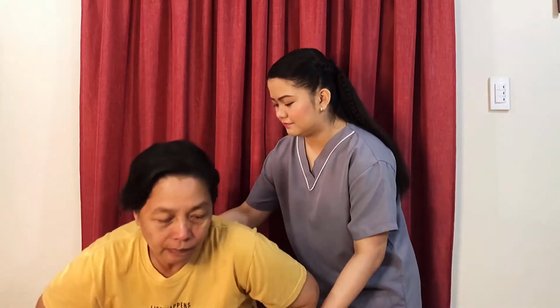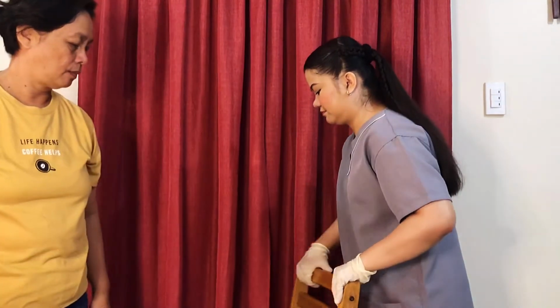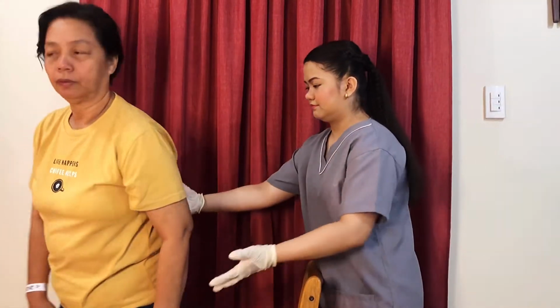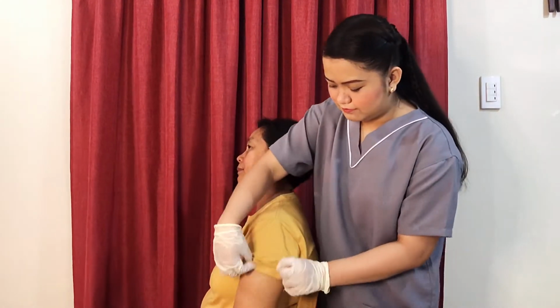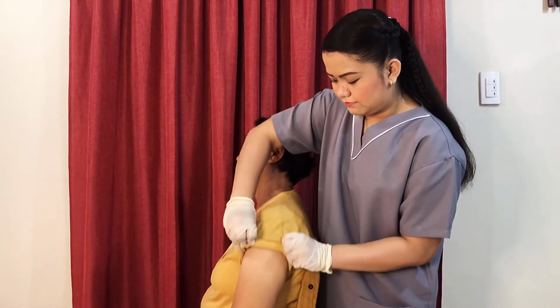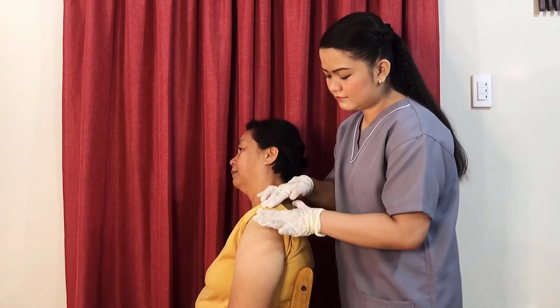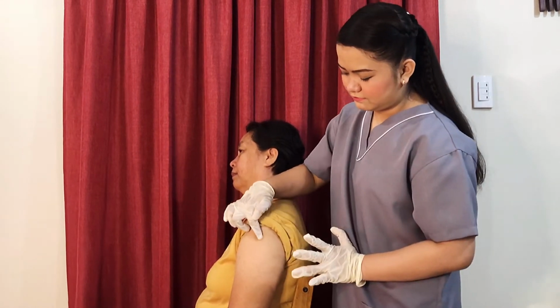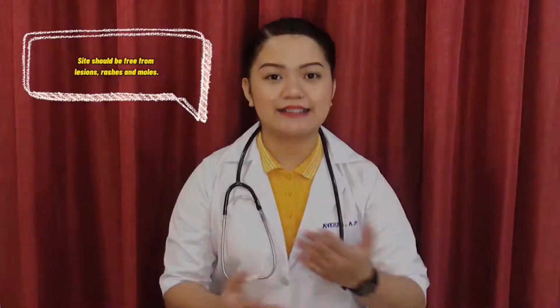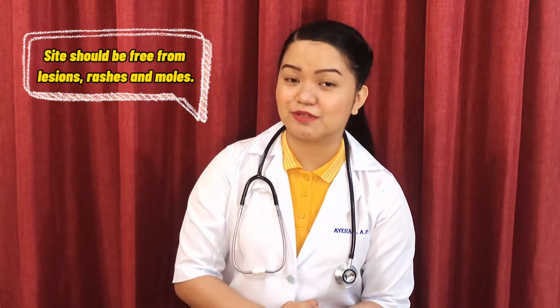Select an appropriate site for administration and assist the patient to the appropriate position as required. The site should be free from lesions, rashes, and moles.